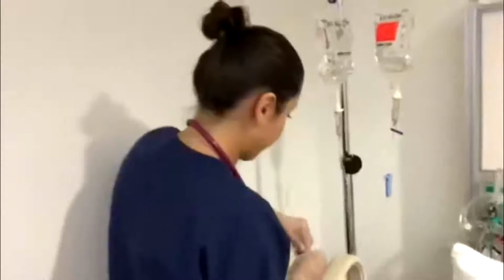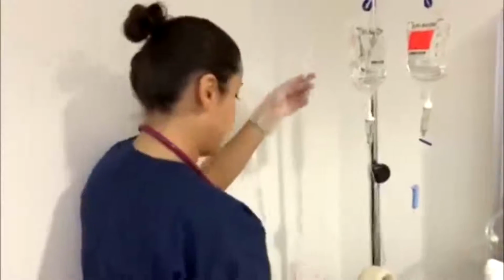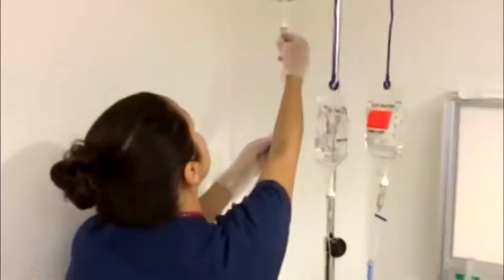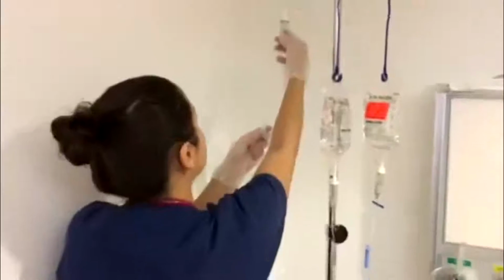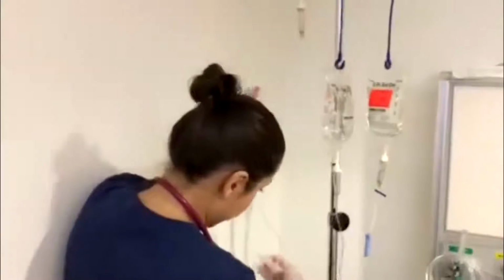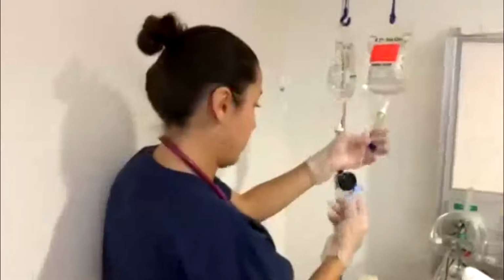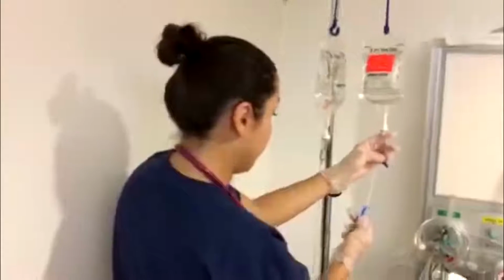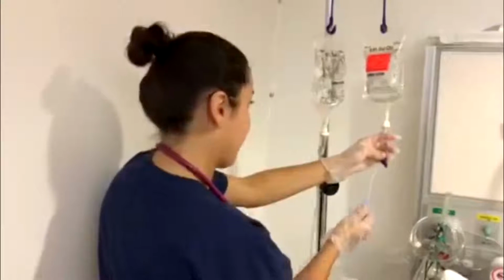Alright, great. So at this point, I just want to prime my tubing and make sure that both are flowing. I want to clamp it before I do. Make sure that it's dripping. Fill the chamber up halfway. This is for Zosyn. And then I'll slowly prime it, making sure that there are no bubbles and that my solution does not flow out. Okay, great. And then I'll clamp that back, and I'll do the same with my sodium chloride. So I'm going to clamp it, make sure that the chamber is dripping and that it's filled halfway, and unclamp it and make sure that it's flowing. Okay, great.